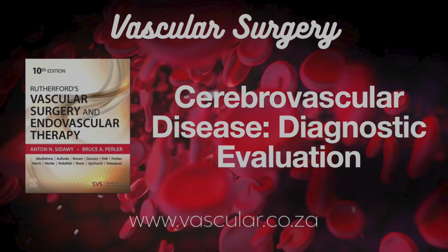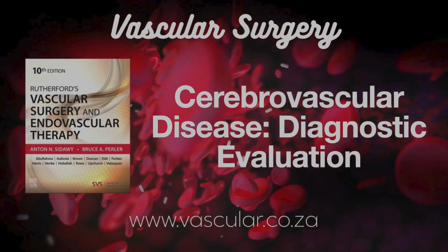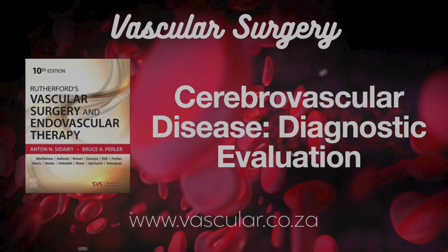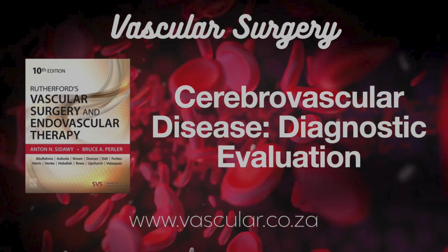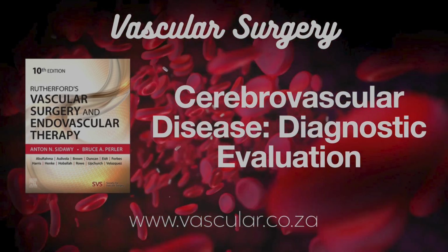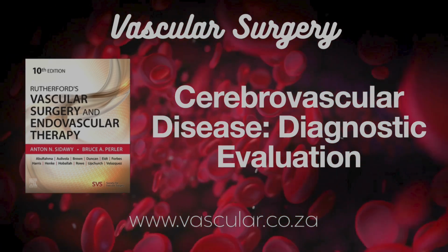You see that on ultrasound, you strongly suspect a carotid body tumor. But for planning surgery? For planning, MDCTA is usually the best. It shows the tumor's blood supply, its full size, if it's on both sides, and exactly how it relates to the arteries and nerves nearby. All crucial for the surgeon.